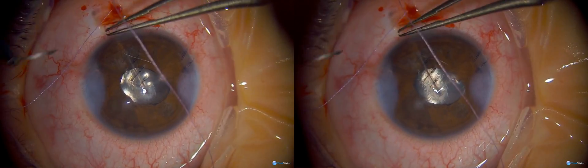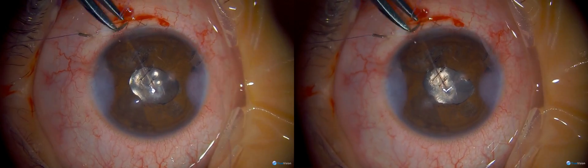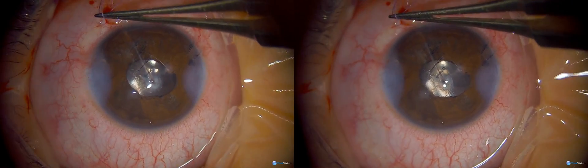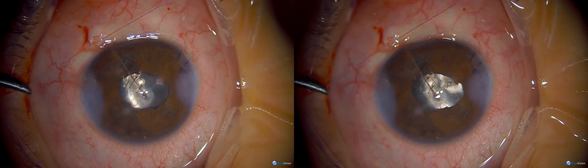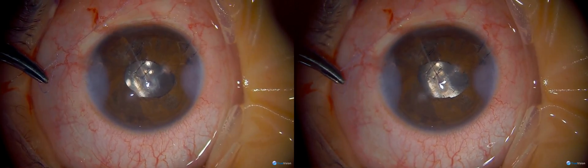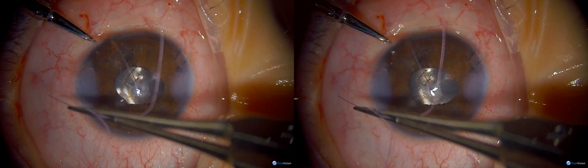I use a steroid-antibiotic combination four times a day for about two weeks. If you do a good clean-out of the lens material, you shouldn't get much inflammation and they should do quite well. Because I buried all my stitches using Vicryl, I don't have to take them back for suture removal. I'll close the conjunctiva with Vicryl as well, so I don't have to worry about it. Now I'm removing the rest of the sutures on the cornea.